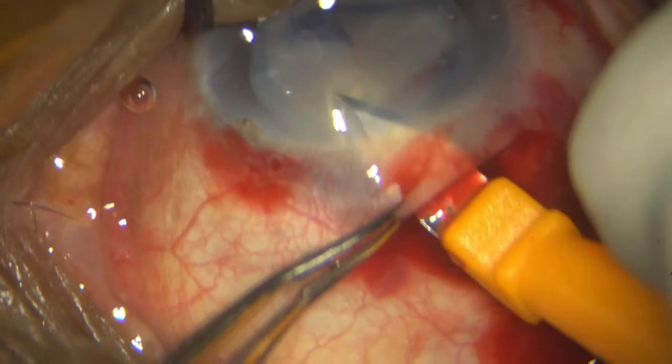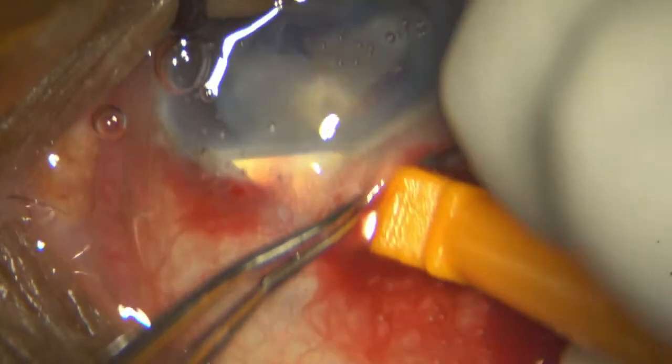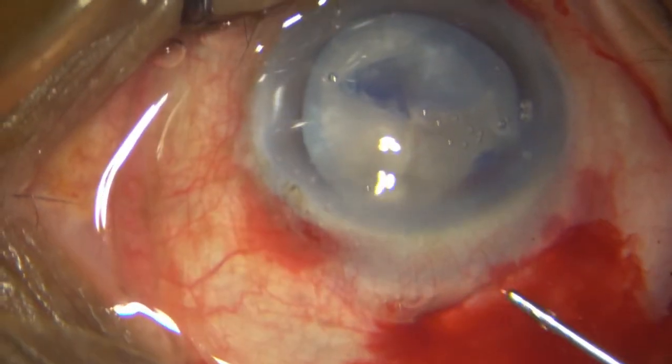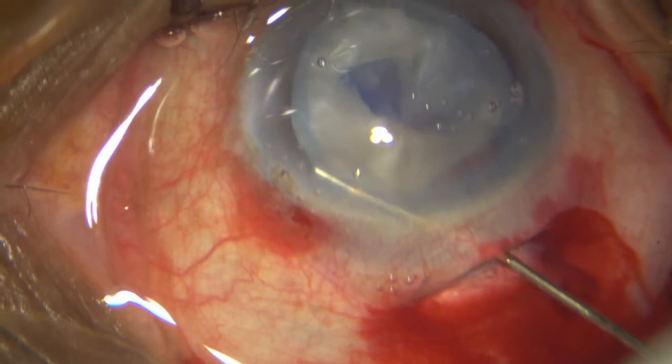Remember, there is no bridal suture in place and hence the globe tends to rotate. Once the incision has been opened completely, I then go ahead and do a hydrodissection, trying to prolapse this nucleus out.